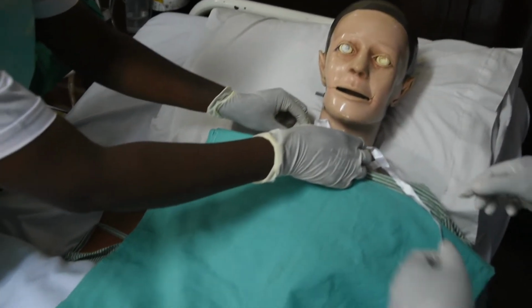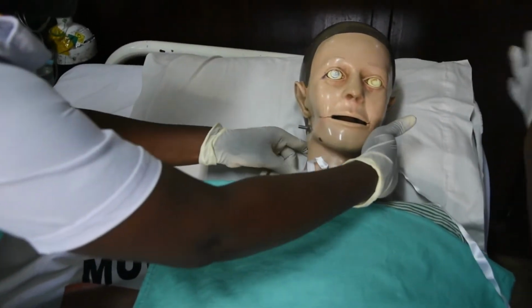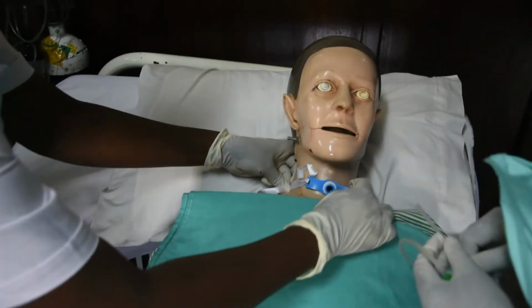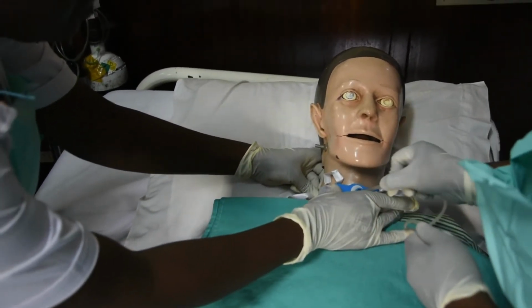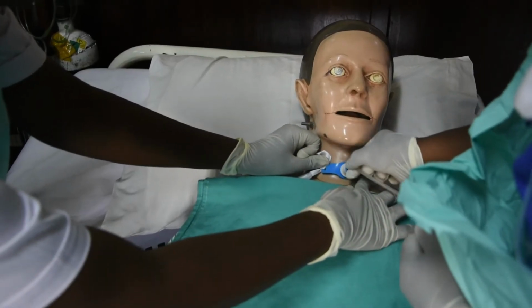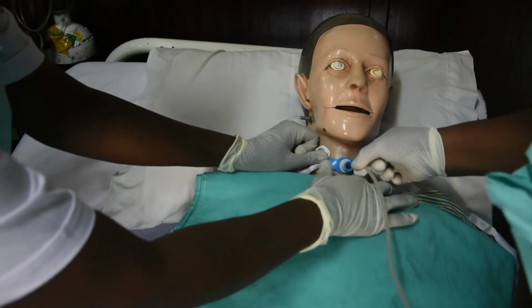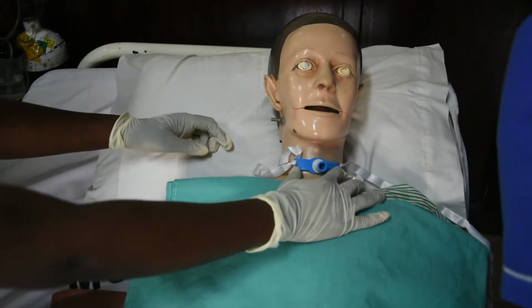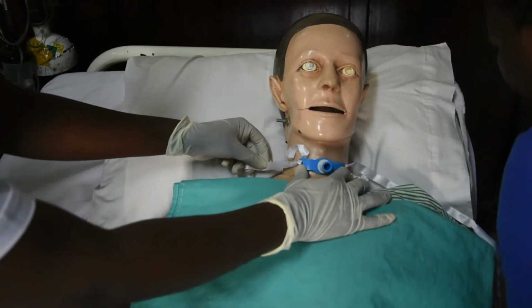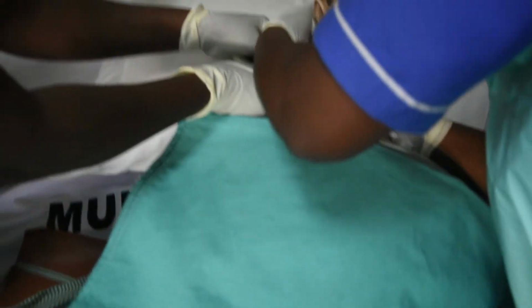First we suction this tube. So you can tighten the strings so that they remain firm to the patient.